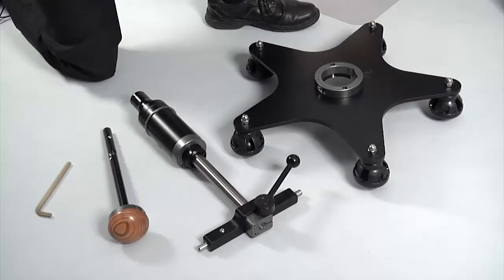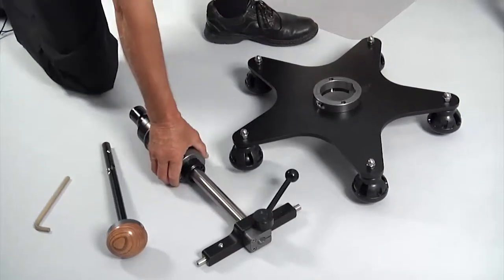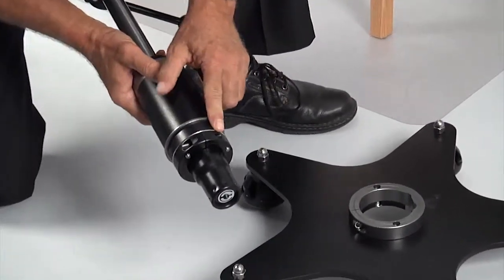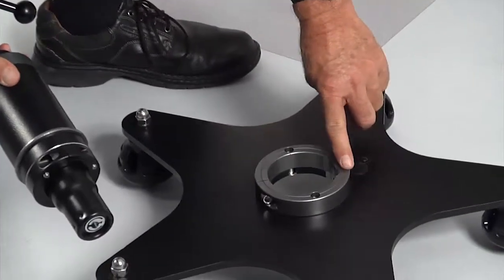The flexion distraction device has three component parts: the star base, the main gas spring component, and the control knob and mast. An allen wrench is included to assist in assembling the device. First, insert the main gas spring component into the star base, lining up the bolts on the main gas spring's round collar with the two recesses in the ring of the star base.